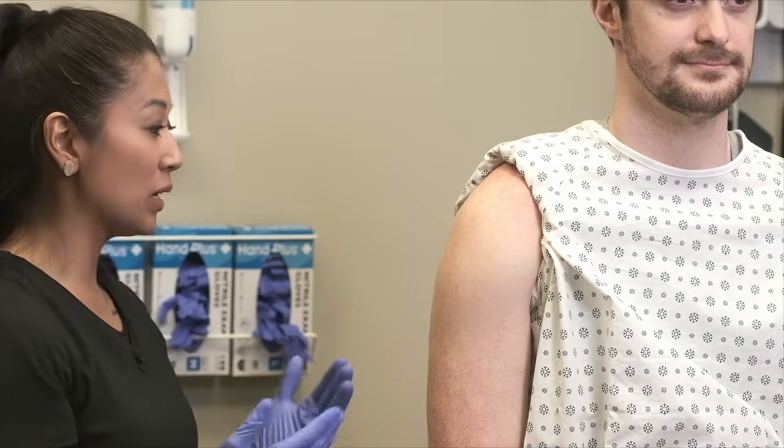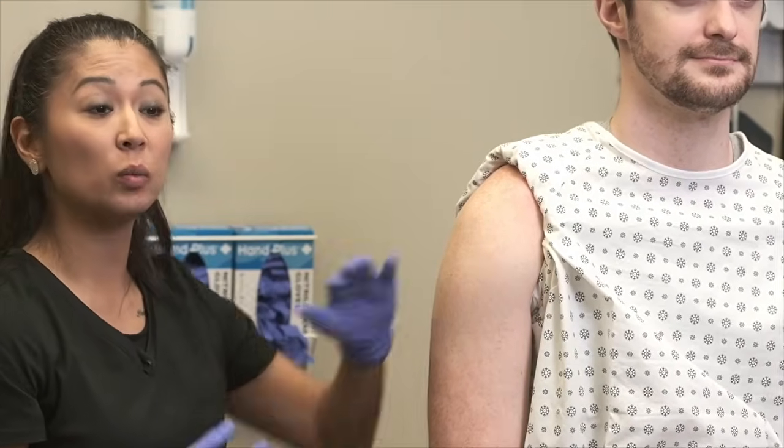All right, so today what I'm going to do is demonstrate a deltoid injection. I've talked previously in regards to injection that this is the most common site that you're going to use, and it's going to be in the deltoid, which is the arm. So let's talk about how we landmark that.